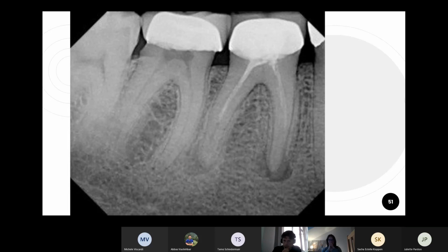There are radiolucencies in the root canal filling. Also, the root canal filling doesn't go all the way to the apex, and on both apexes it's already causing problems. You see the periapical lesions on both of them, so you definitely have to redo this endo. And in the worst case, the tooth has to be extracted if the inflammation can't be brought under control.